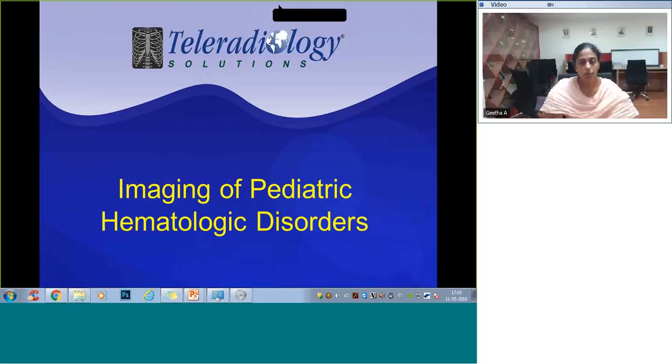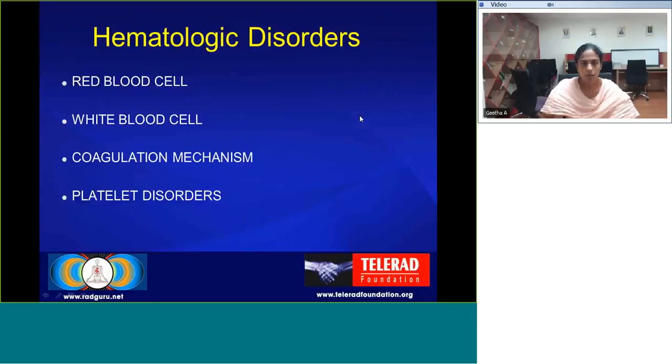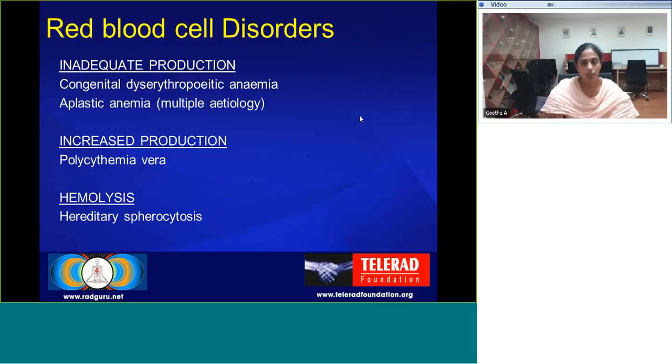Speaking on the imaging of pediatric hematological disorders. These are divided as disorders of the red blood cells, white blood cells, coagulation mechanism, and platelet disorders.